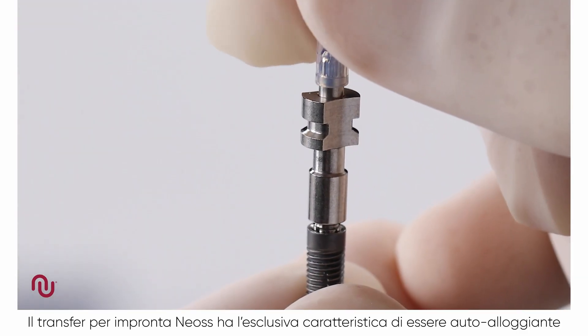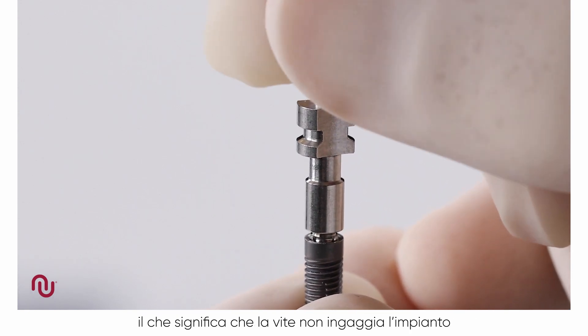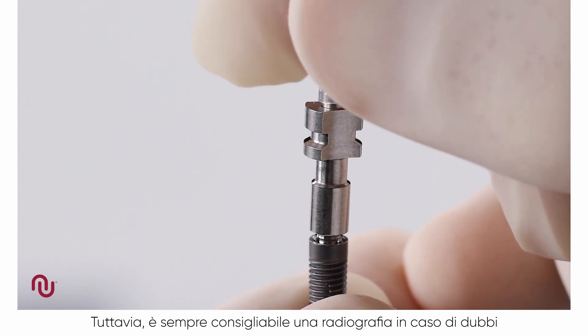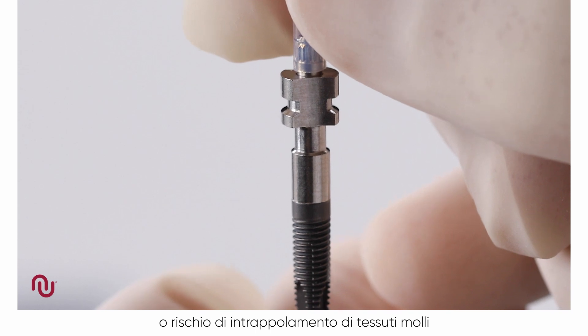A unique feature of all NEOS impression copings is that they are self seating. This means that the screw will not engage the implant if the coping is not correctly seated. However, a radiograph is recommended if there is any uncertainty or risk of soft tissue entrapment.